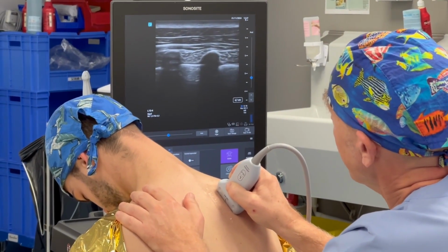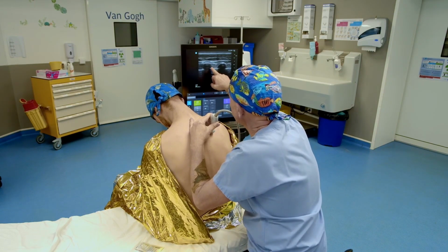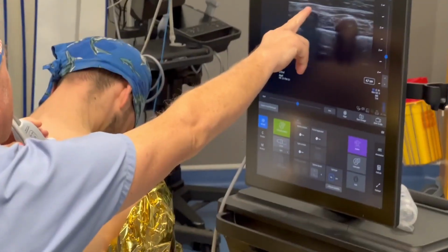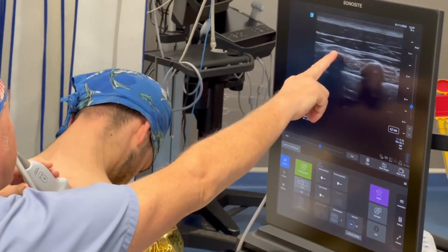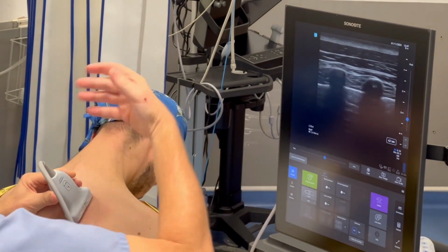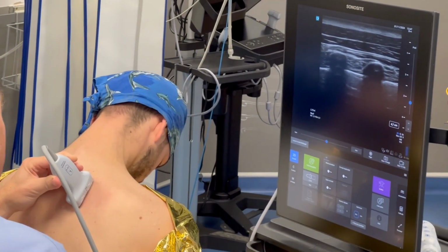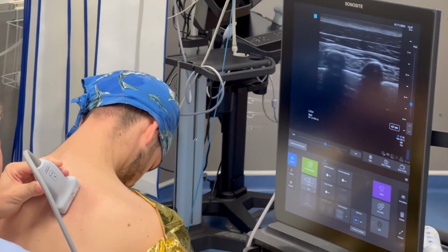So you see like this. Now a small clarification. This is the paravertebral block. At this level, it's the mid block. And here you have an erector spinae block in contact with the apophysis. So this is really the most effective. But sometimes it's a slightly tricky block, a bit deeper. We're getting close to structures, but it covers the entire surgery.